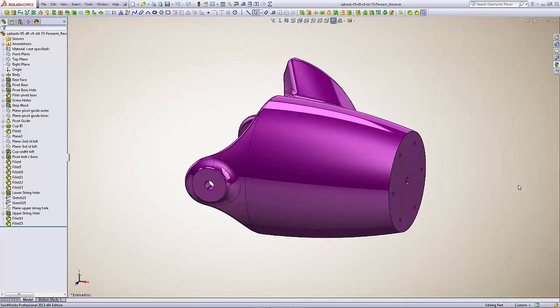Hi everybody, my name is Nick and today I'll be showing you how to modify the RIT Arm Forearm Cup that I have uploaded on Thingiverse.